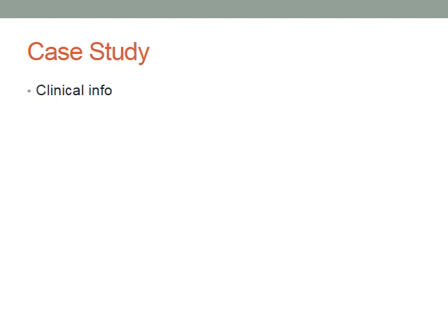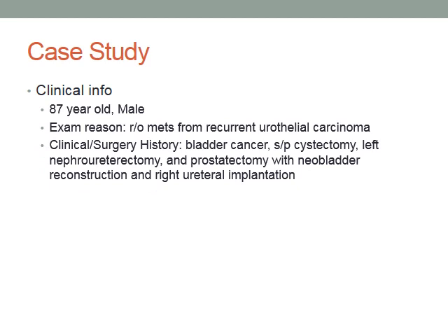Unfortunately, I couldn't find a trauma patient in our PACS when searching, but luckily I found an interesting case combing through our PACS. This involves an 87-year-old male with recurrent urothelial carcinoma. The exam reason is to rule out mets from his recurrent carcinoma.